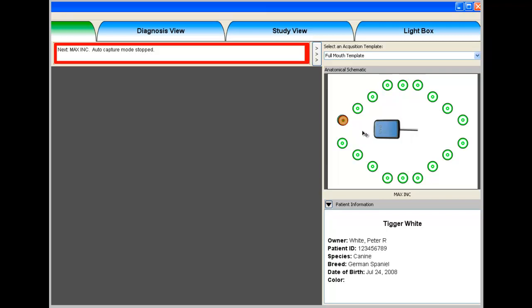You may simply, for instance, use this position or perhaps this one or this one for taking all the cheek teeth in one shot, as an example. You may be able to get both the 104 canine and the 204 canine and the incisors by simply choosing any one of these 3. For that case, I'd probably find that the upper incisor would make the most sense, because the radiograph that I would get as a result of that would show the 204 canine and the 104.